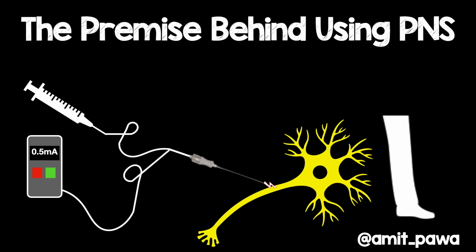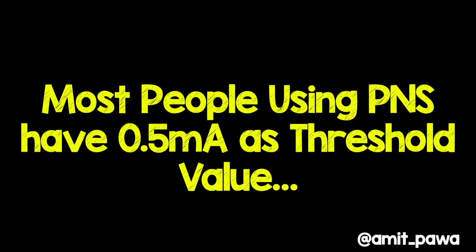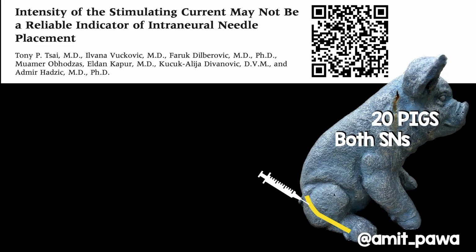We then reduce the current to that threshold level and use that as a guide for how close we are to the nerve. But the question is: is this always reliable? Now, you've heard Dr. Gadsden talking about using 0.2 milliamps, but I know for a fact that most people, when they're using these techniques, have the twitcher on at 0.5 milliamps as a threshold value. Now, armed with that knowledge, let's have a look at some papers.